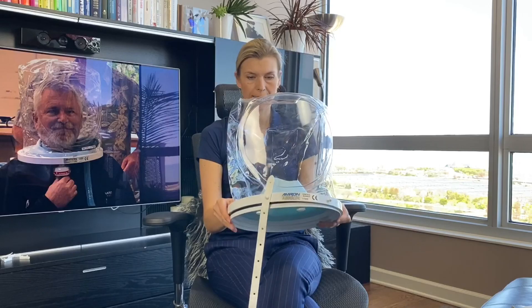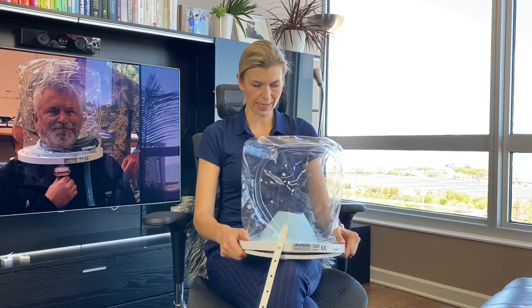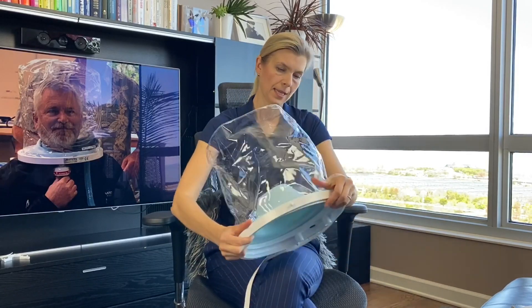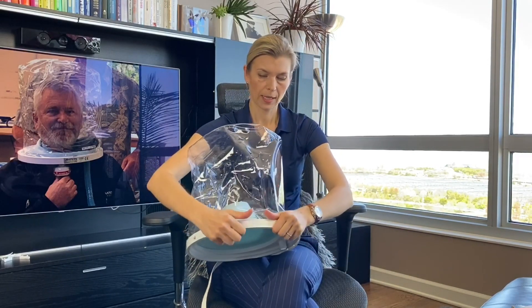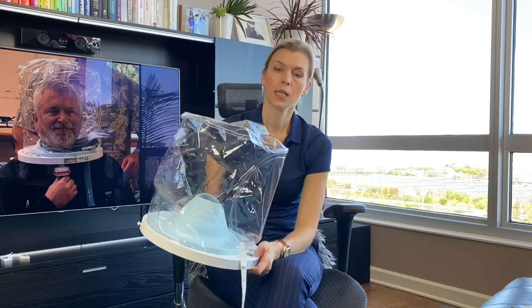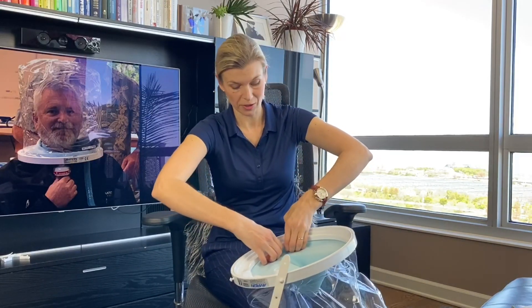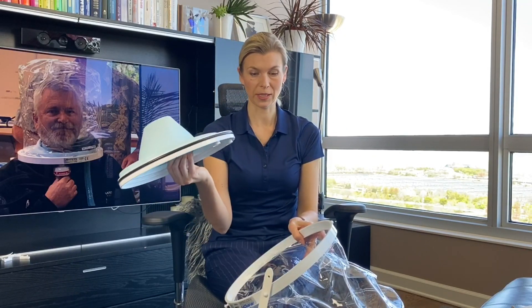Now let's see if we can put these pieces together easily. It snaps on very easily, as you can see. What is nice about this helmet is that it will hold the high pressure used for non-invasive ventilation. The helmet will start to separate around 40–50 of PEEP, and that's a safety feature. You definitely want to use a lubricant on the ring, so it's going to be even easier to snap these two pieces on or off.